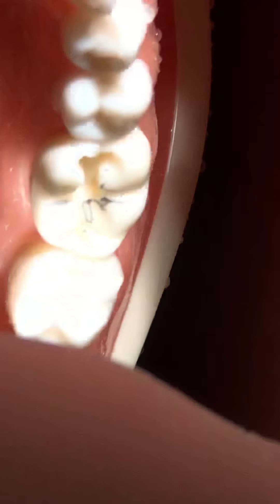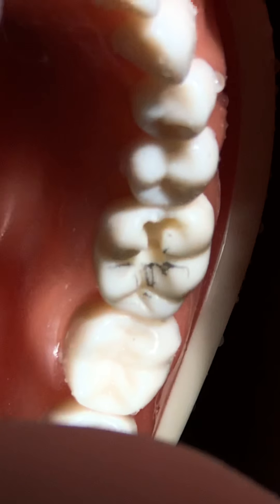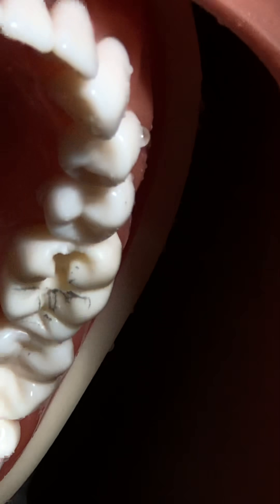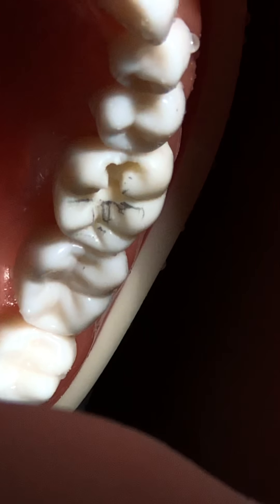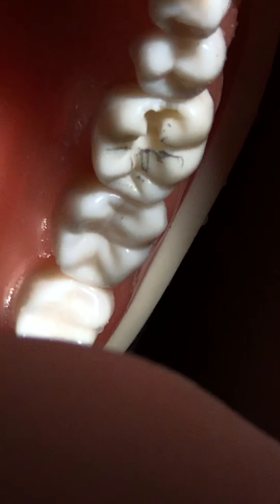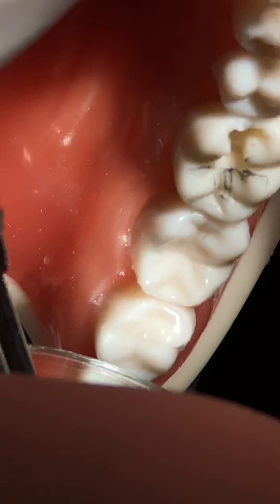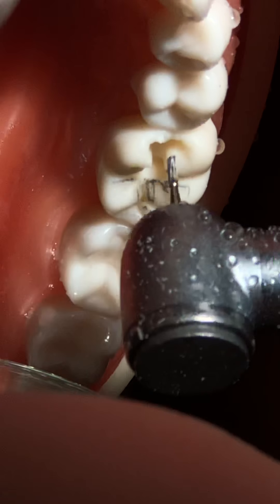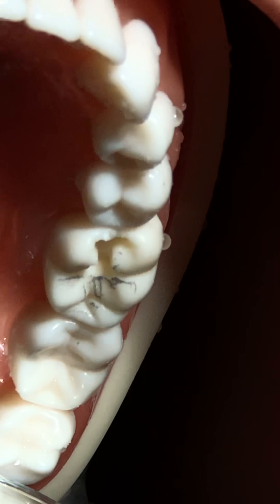Going into the margin ridges, we did not extend to the other side. There are two approaches: either you go towards the distal margin ridge and make a full outline form, or you stay in the middle. The dovetail in the mid portion is sufficient, but you can extend it. The important thing is the proximal extension - you see two prongs here, which are translations of the secondary grooves going into the margin ridges.